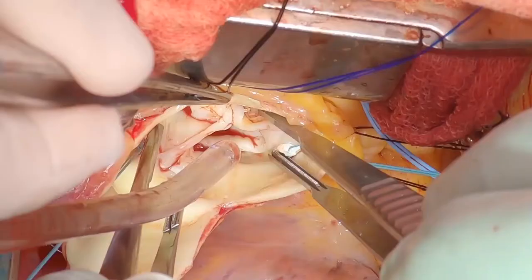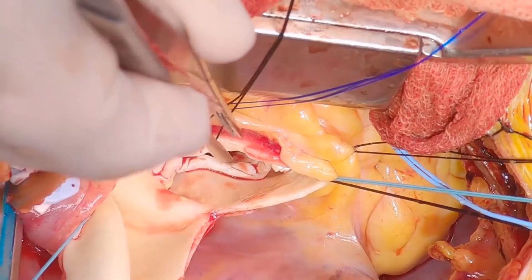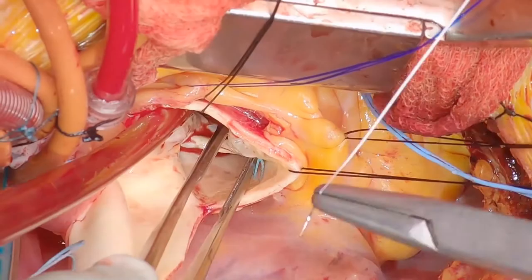There you see it's symmetrical now with the right tension. Then I have a look to make sure I have a large enough opening. I'll often put a Hegar gauge in there to make sure I have a big enough opening for the patient's BSA. Having done that, the next step is the Gore-Tex suture.